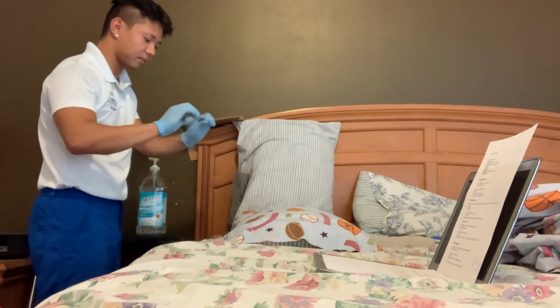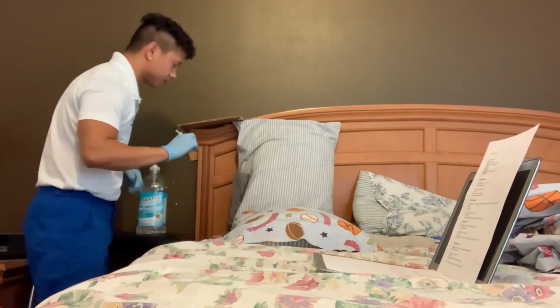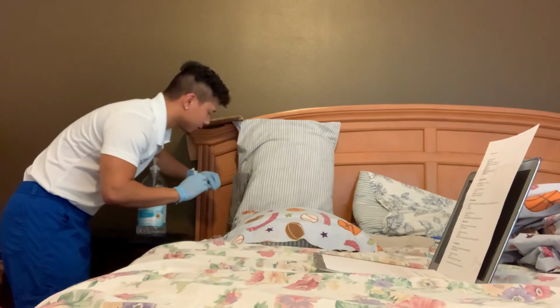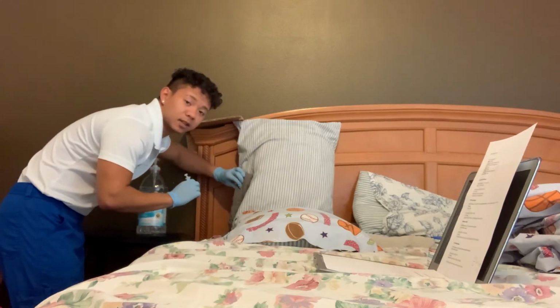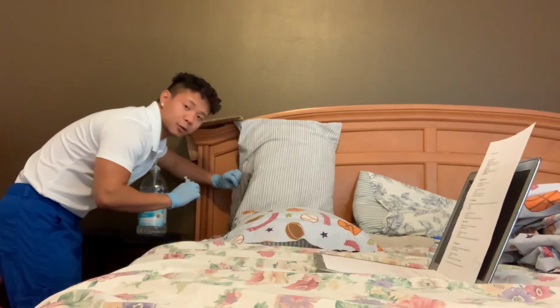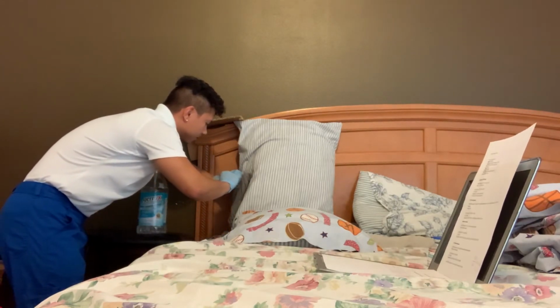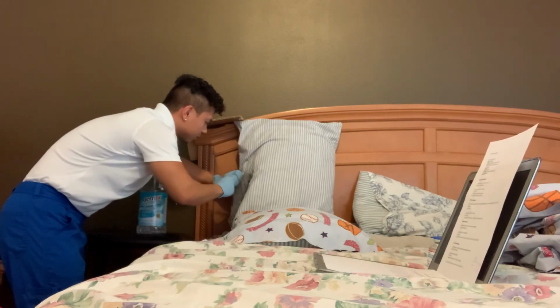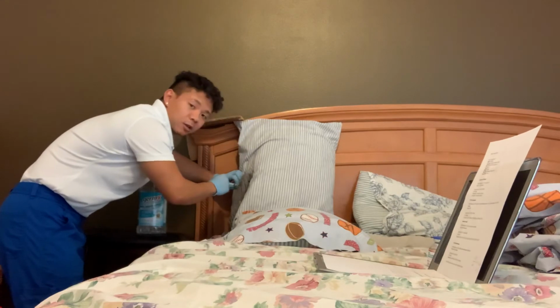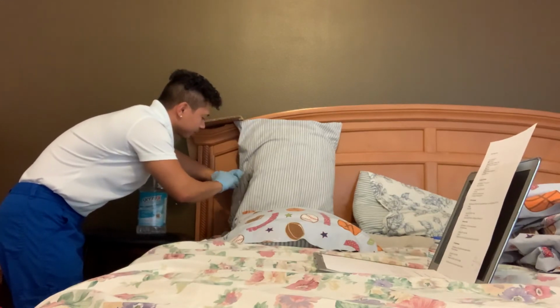So I'm going to uncap. I'm going to hold it like a dart. And I'm going to Z-track it. So I'm going to pull the skin away from the site, about 1 inch away. And I'm going to go 90 degrees, inject. So I injected it slowly, hold for 5 seconds, and release.